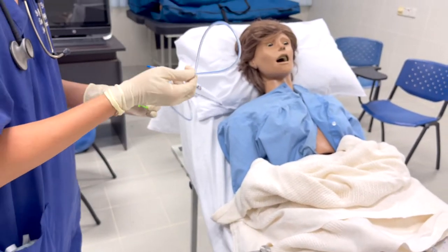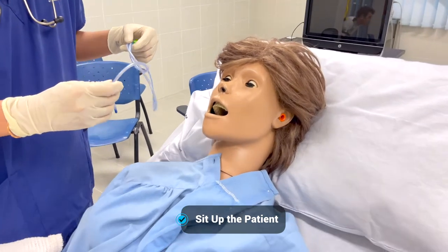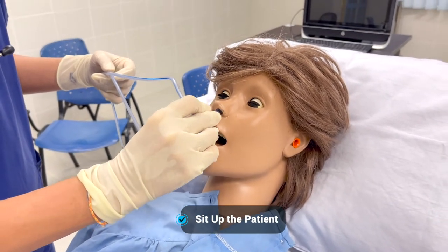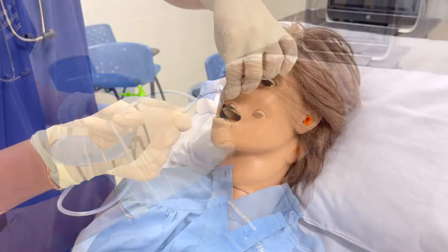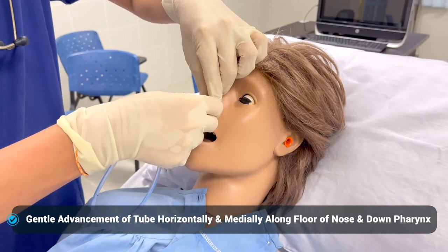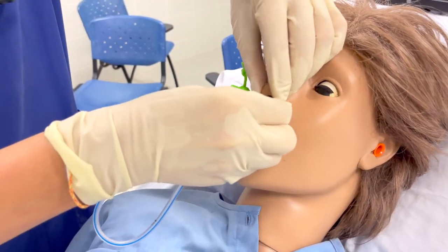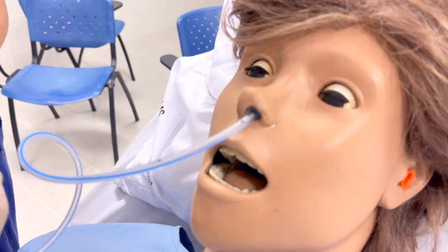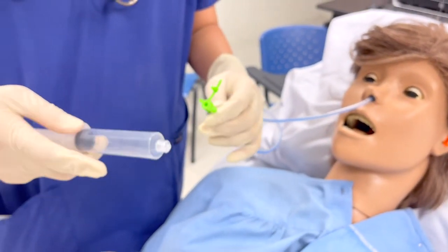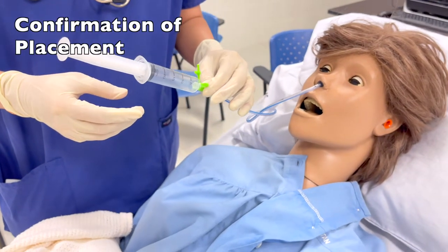Gently inform the patient: 'Mrs. Elise, I'm going to insert the Ryles tube now — you may feel a bit uncomfortable, please bear with me.' Insert the Ryles tube gently and advance it to the target length of around 60 centimeters — counting 50, 55, 60 centimeters. Once at 60 centimeters, we ask our assistant to inflate air into the tube.